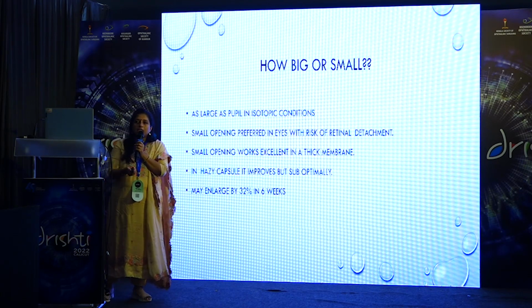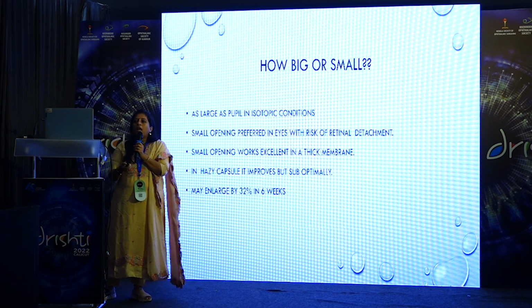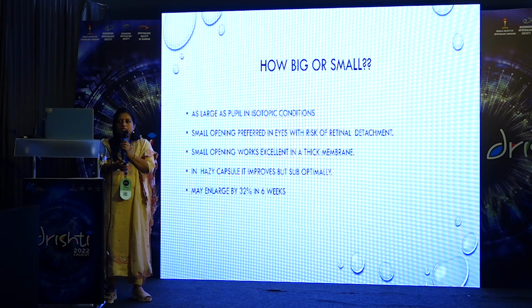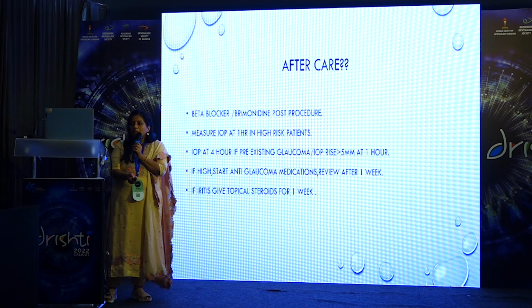Now, what should be the size of the capsulotomy? Ideally, it should be the size of the pupil in normal lighting conditions. If it is a thick membrane, even a smaller opening will work wonders. That is what studies say, because it has a tendency to expand around 30% a few weeks later. But if it's a very thin and hazy capsule, the results may be suboptimal.